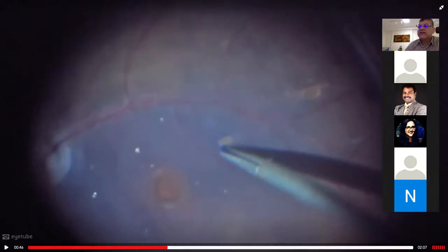It's not always easy to create the tear. You don't go deep into the retina — you get the ILM with a pinch movement in the macular area, just below the arcade. You have the brilliant blue staining the ILM very well, giving a pretty good view. You created a small tear there — just a tiny one — and then spread it, going towards the inferior part.